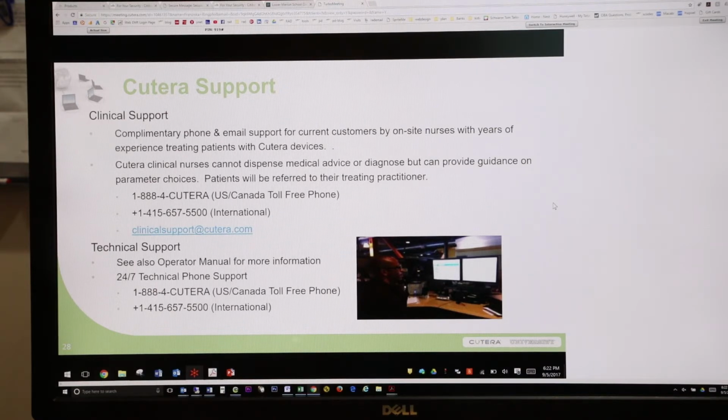I heard that you should not move the laser from one place to another. It's because of the mirrors. You can move it from room to room if you're treating in different rooms, but as with all devices, the path should not be bumpy. The problem with moving devices from place to place is that there's a water reservoir that you have to worry about, and also with your particular system, the articulated arm.